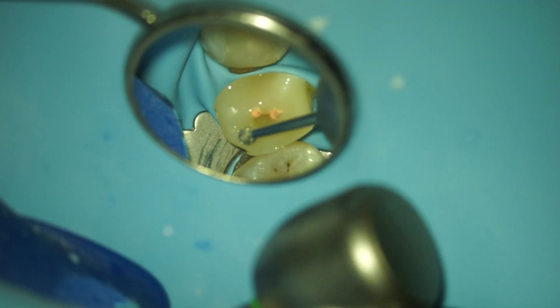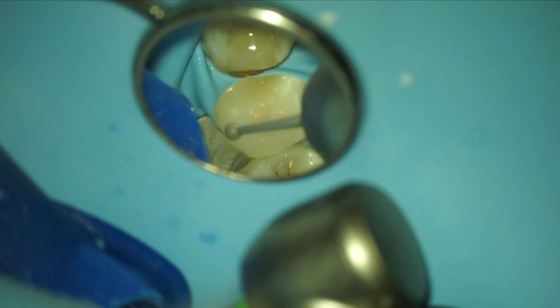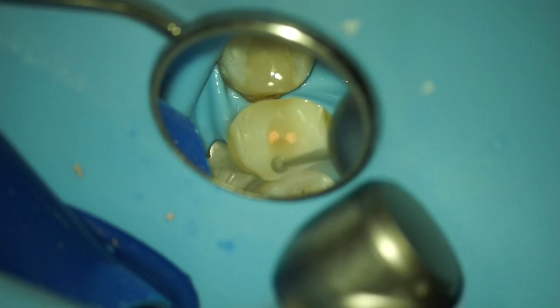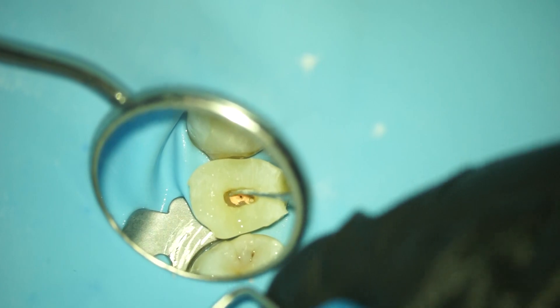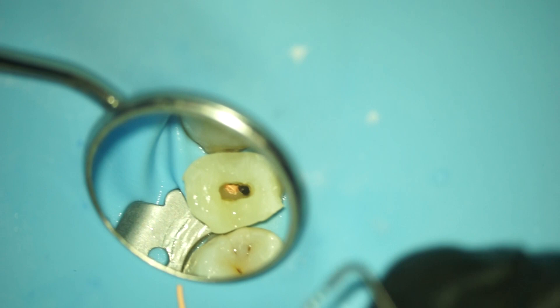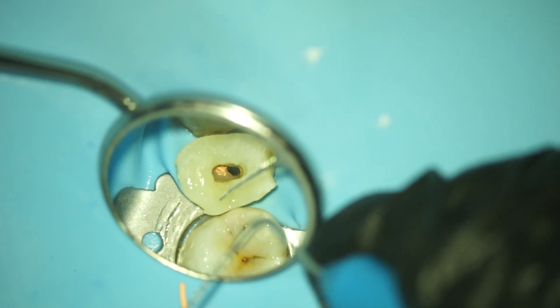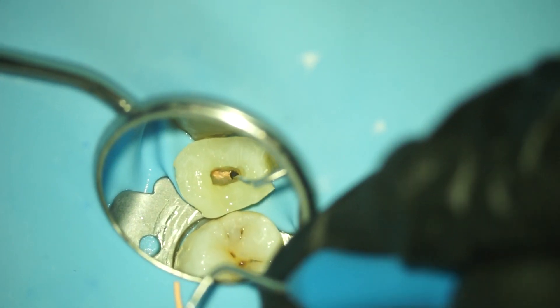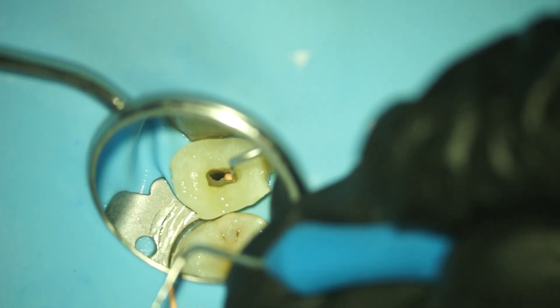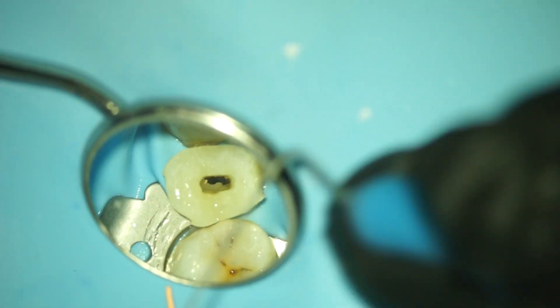Then I reduce the bulk of the pre-endo buildup — reducing the height, making sure I have a flat surface. As you can see, the gutta percha easily comes out. It's not stuck to the canal wall or anything, so you can simply remove them and then prepare the opening cavity further.